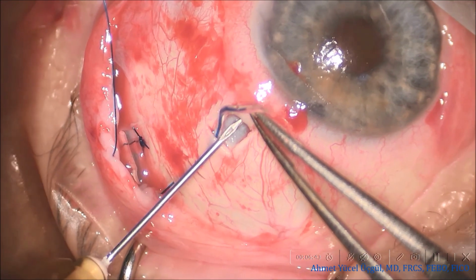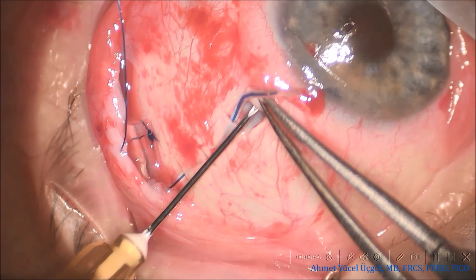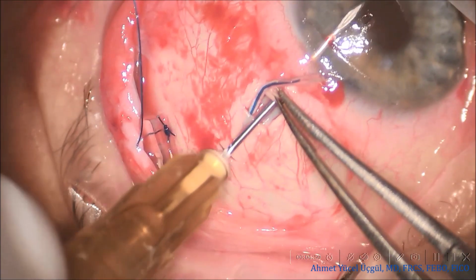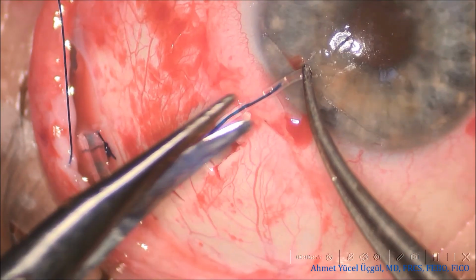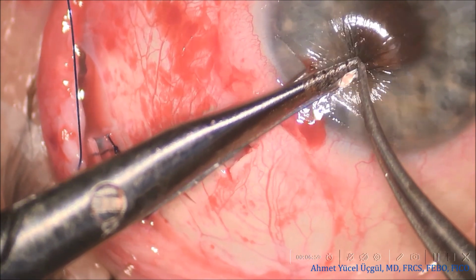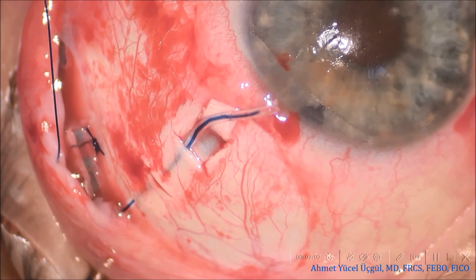However, the most important point is to estimate the intended anterior chamber entry level before injecting the viscoelastic. Once the OVD is injected, the iris is pushed posteriorly. If the entry site is then judged only by centering between the cornea and the displaced iris, there is a real risk of entering too posteriorly and injuring the iris root. This can lead to post-operative resistant hyphema, and in a hypotonic eye, controlling hyphema can be particularly difficult.